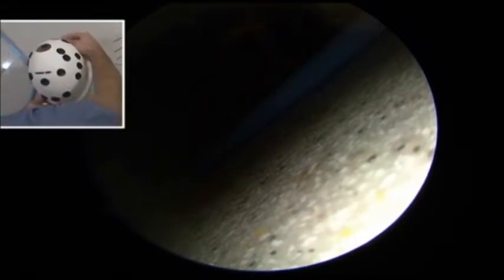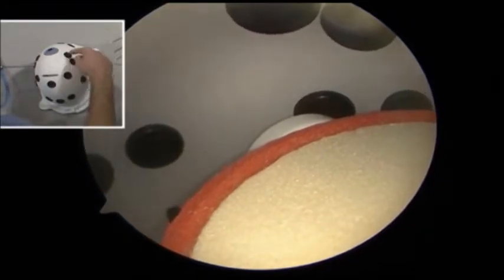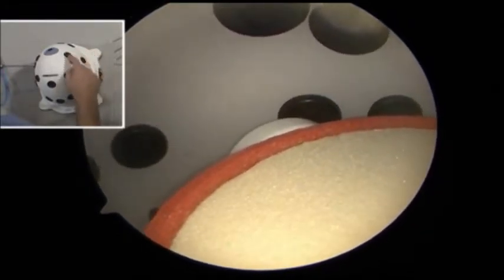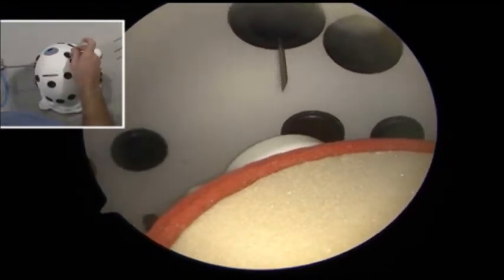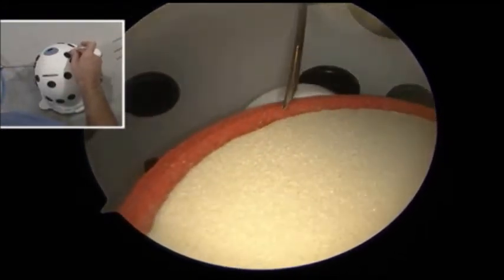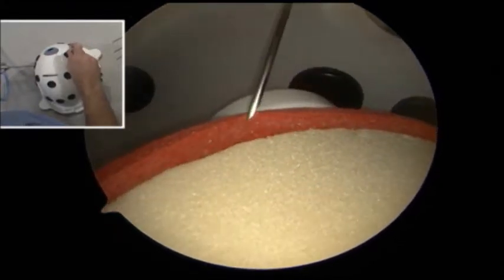We're going to do this under arthroscopic visualization. We're going to use this as our posterior viewing portal. We've got a high anterior portal here and a low anterior portal here. We'll take our spinal needle to again get a good trajectory on our target. And this is our glenoid labrum.